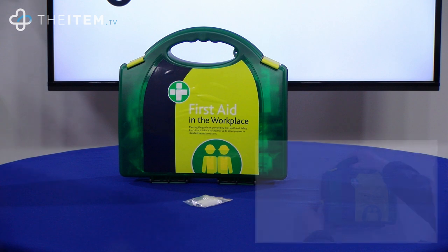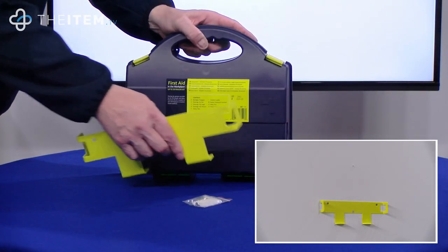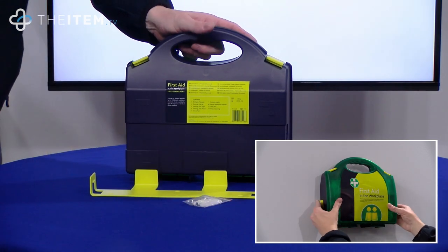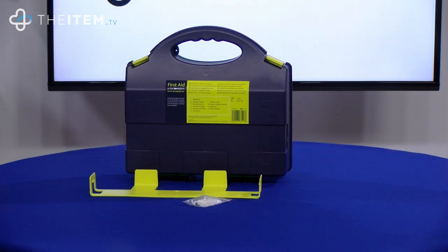Aura boxes come complete with a wall mounting bracket and fittings on the back of the box. Simply take the bracket off, screw it with the fixings onto the wall, and that way there's no need to buy a separate first aid cabinet.